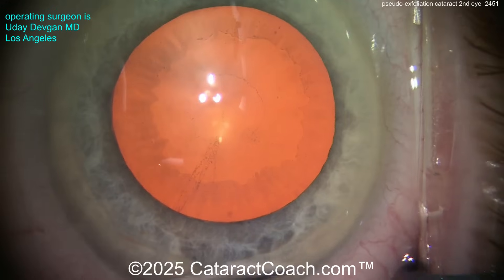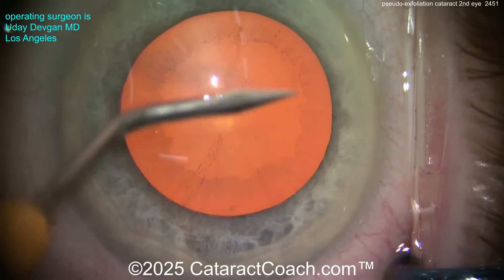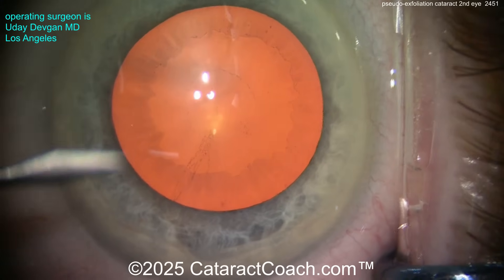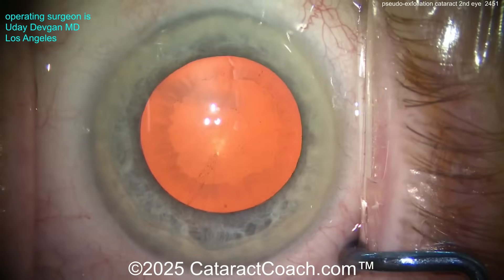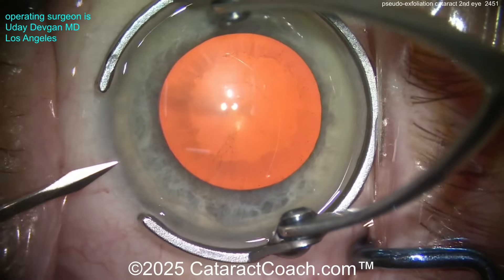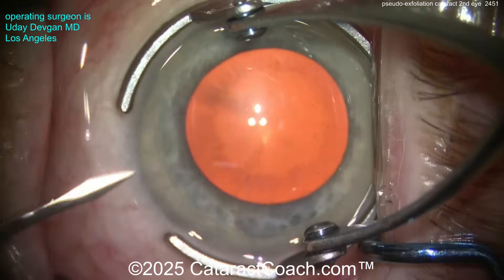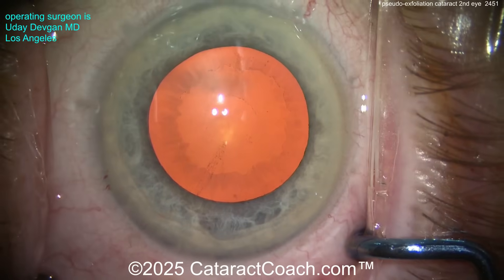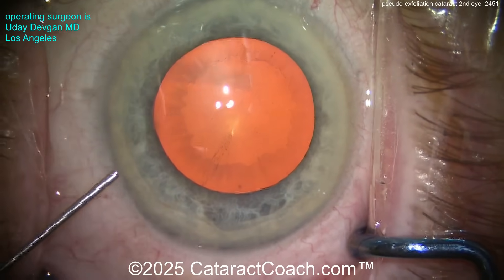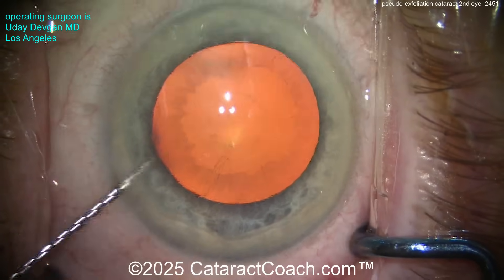The other eye had surgery years ago and now has a phimotic anterior capsule, but still has reasonable zonular support in the first eye. So what do you do? Well, first thing you do is give the other surgeon the benefit of the doubt. Assume that the other surgeon did a really beautiful job, because probably that's the case — the patient has challenges with the tissue, the anatomy, the healing, and the physiology, of course. So in the second eye, what should we do differently?